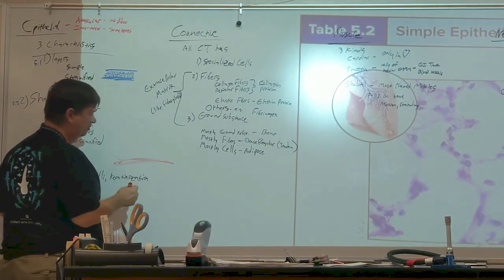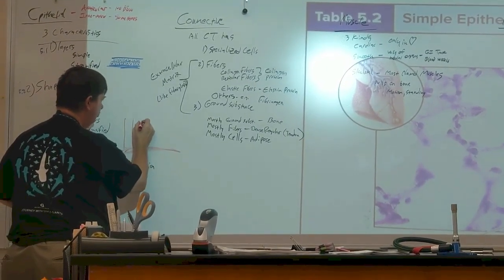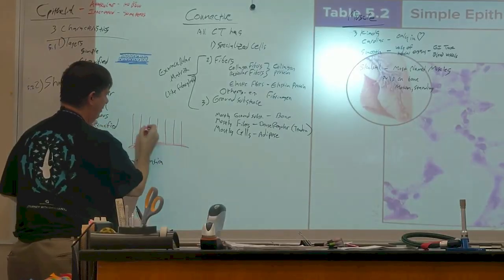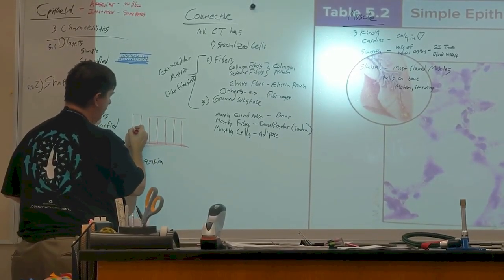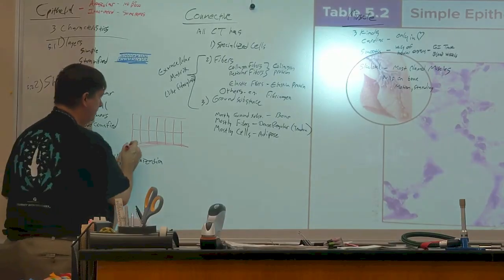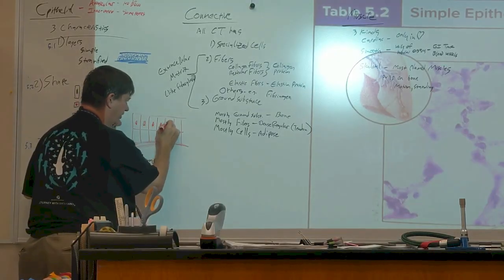We've got some collagen fibers that form the basement membrane. And we're going to draw it tall. And you might say, oh, he's drawing columnar tissue. I'm going to divide it like that, and we'll still say it's columnar because it's taller than it is wide. Do you agree? But here's the thing. Columnar tissue, you'd be having this go on with the nuclei. Do you agree?